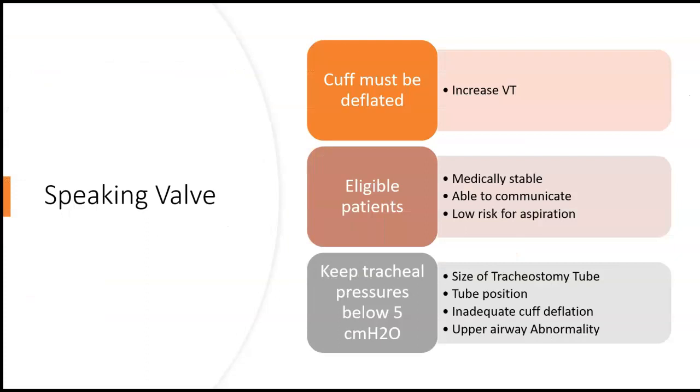Back to this. Just a couple important pieces with using speaking valves is that it's really important that you deflate the cuff when you are utilizing it. Okay, so you have to have that cuff deflated.